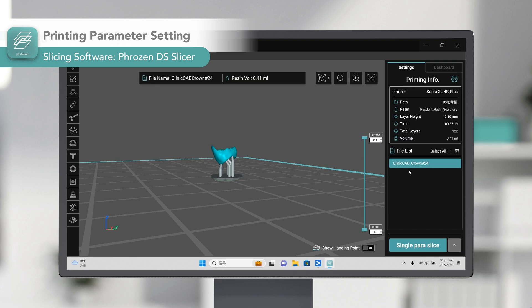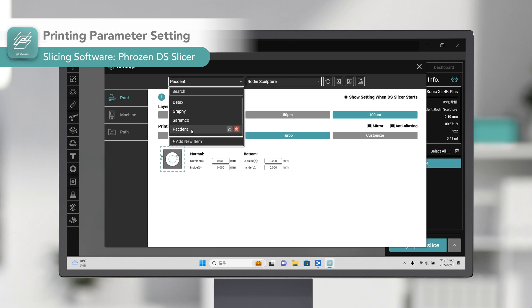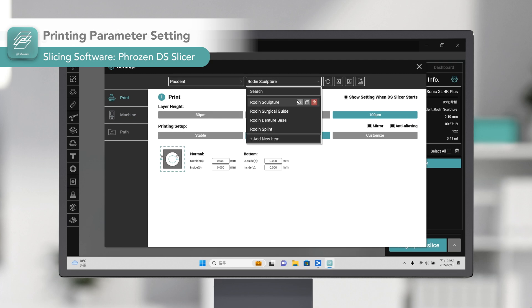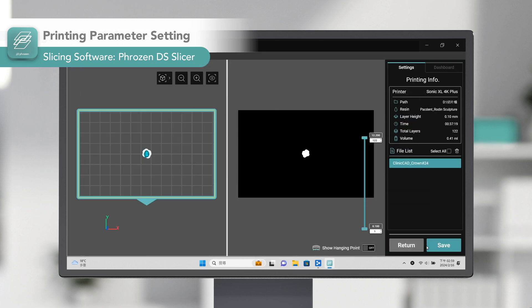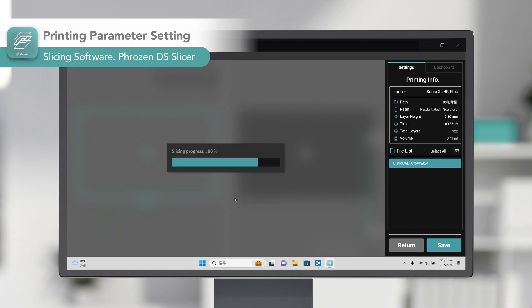Then we are going to set the resin profile. Each printer and resin have different resin profiles, and choosing the proper settings is crucial for a successful and accurate print. However, DSDSlicer provides pre-validated settings for all resins compatible with the Frozen Dental printer. You only need to select your printer and resin, and it will prepare a ready-to-print file with the correct settings.